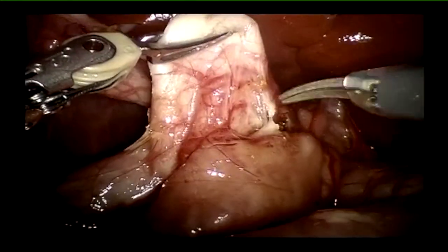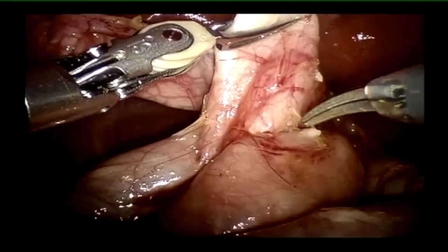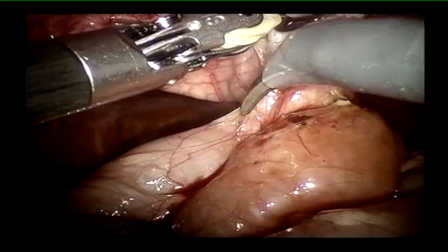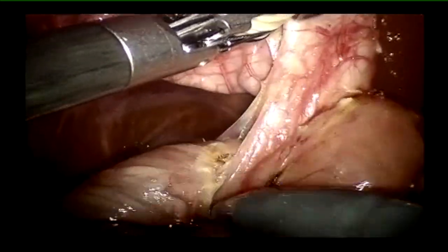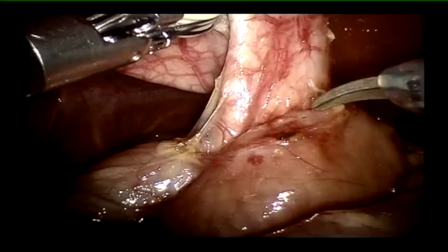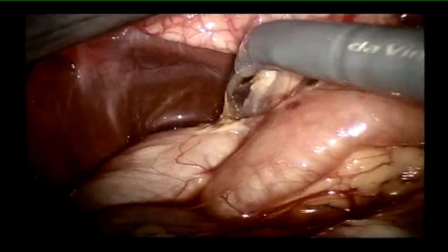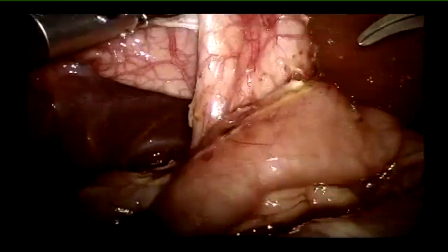Once you feel comfortable, you decide to move on to kids smaller than five kilos. A lot of literature says operating on kids less than 10 kg can be difficult, but I think it's an individualized thing — it's about how comfortable you get with the robotic technique and working with the robot as an instrument. That should guide stepwise increments in procedure complexity, case type, and the size of the baby on whom you're operating.